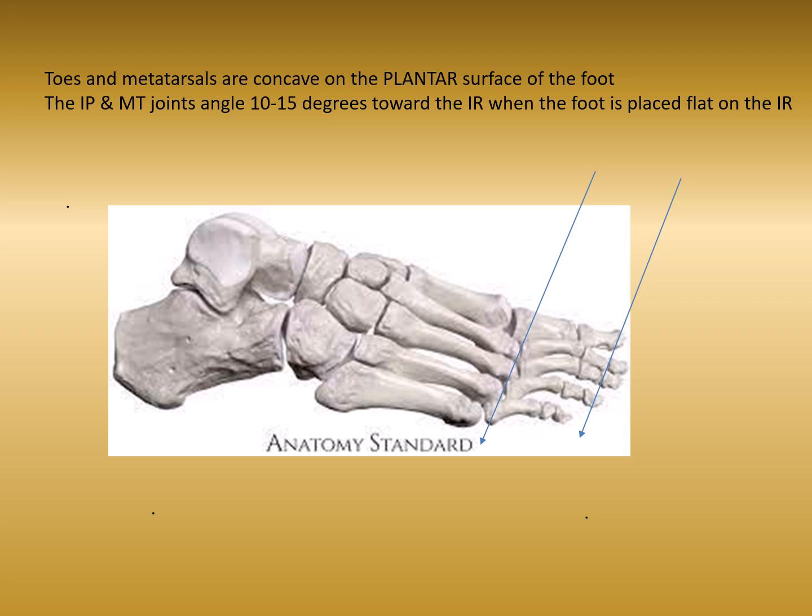do with our central ray placement is turn and angle the central ray so that the X-ray beam goes through the joint spaces without crisscrossing the bones. So if we took a perpendicular central ray, what would happen is that we would hit bone and be projecting bone into those joint spaces. We would be hitting the bone and projecting it into the joint spaces.